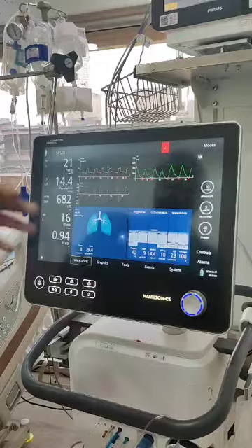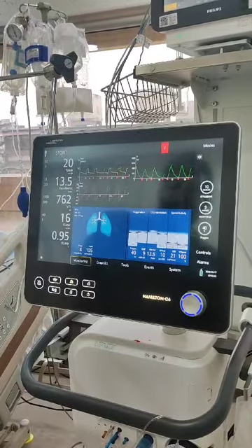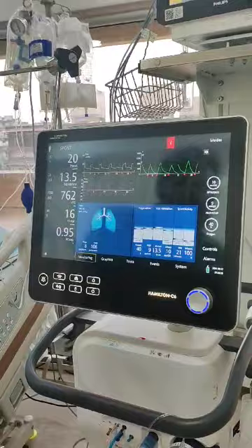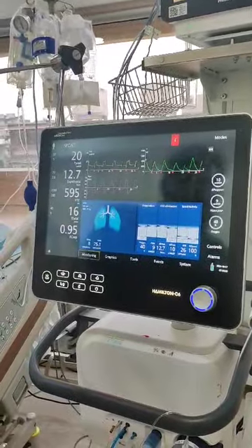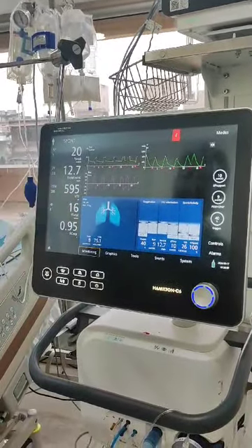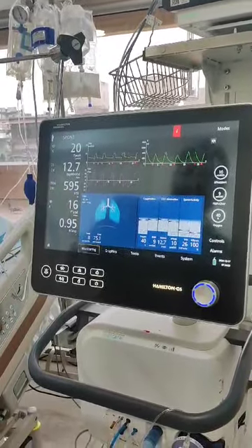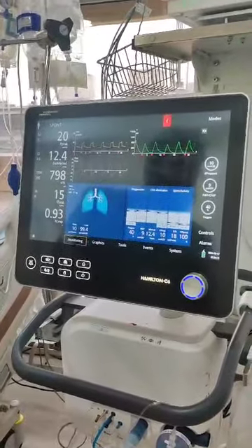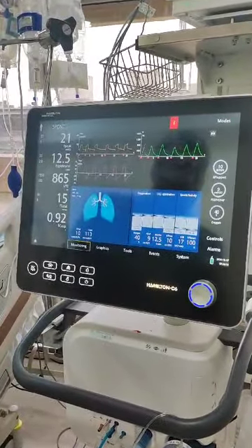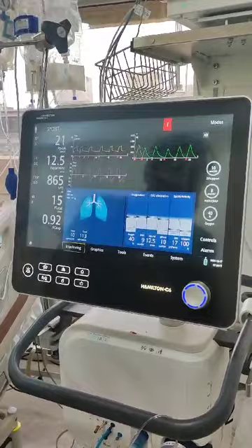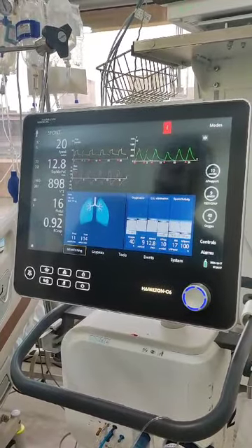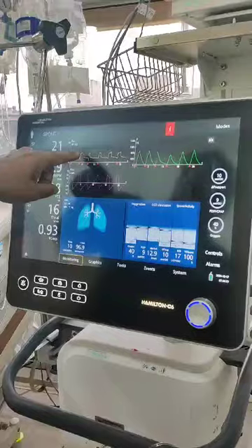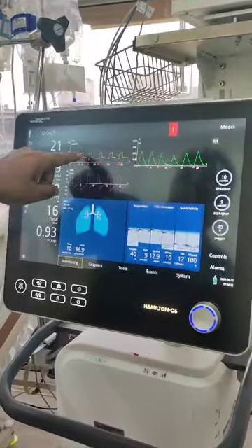Now if anybody looks at this ventilator, you might think the reading of 762 means it's too much assist that we are giving, and that's the reason the tidal volumes are on the higher side. You also see the graphs over here. Do you notice any problems in the graph? I do notice the problem — there is a small blip at the end of expiration.